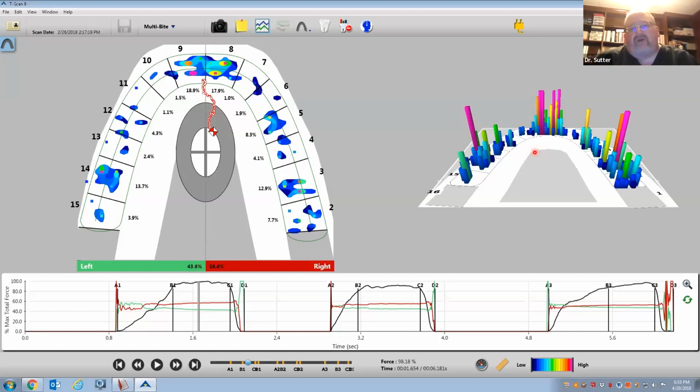These 2 teeth are overloaded, right? And you don't need to go to dental school to look at this and get some understanding at a layman's level of what's going on. And so mom's like, well, I just paid $7,000 to have her bite fixed. I'm like, no, Mrs. Jones, you didn't. You paid to have her teeth straightened. Her bite is not fixed. And that's not what ortho does. They don't create bites, they create straight teeth.